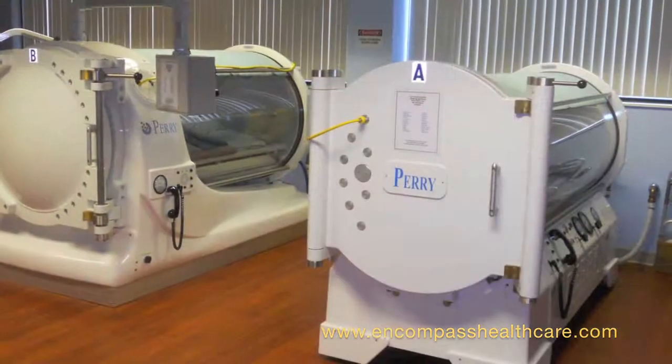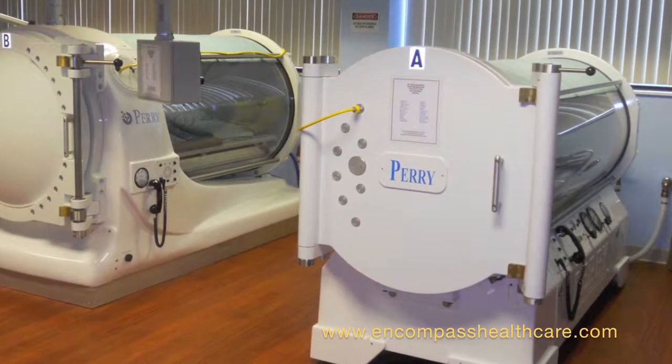During the course of this test, we'll likely give this individual some oxygen supplement to see if the oxygen concentration rises with the leads on. If it does, he might be a candidate for hyperbaric oxygen therapy, which will help us get that concentration of oxygen high enough so that he'll be able to heal that wound.